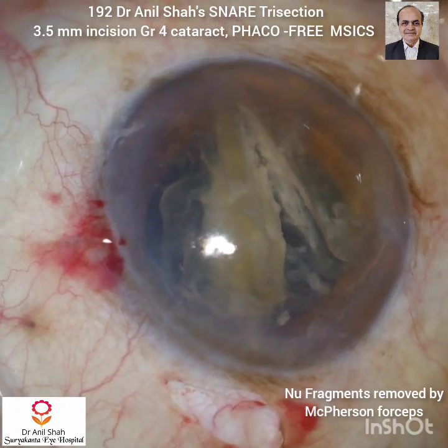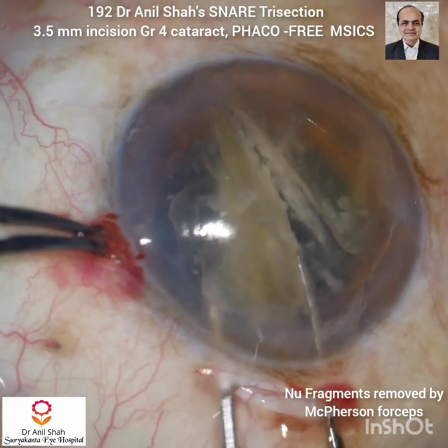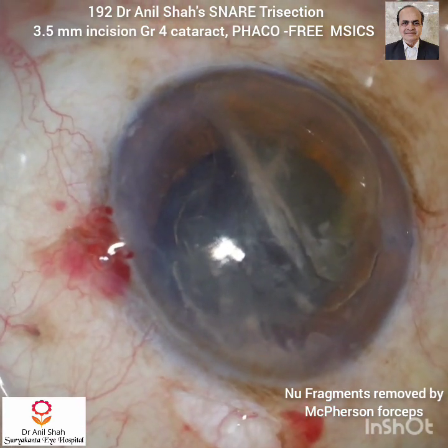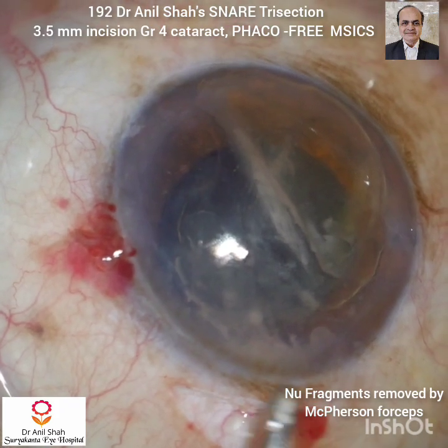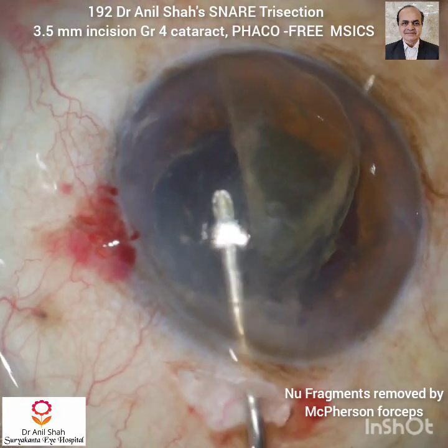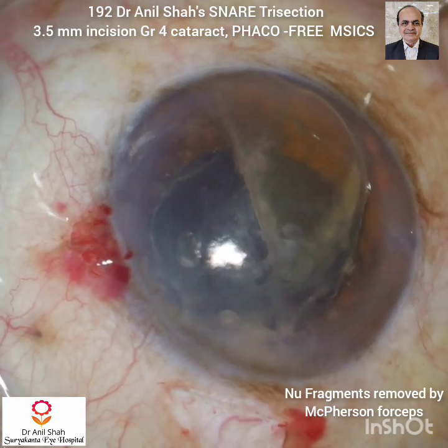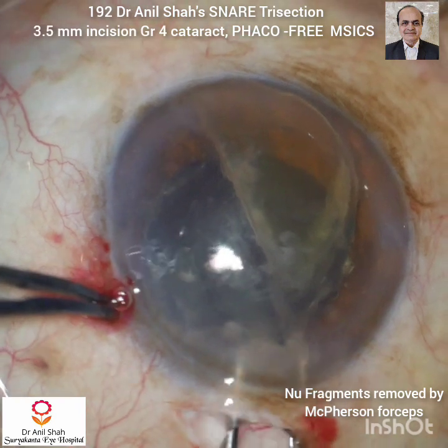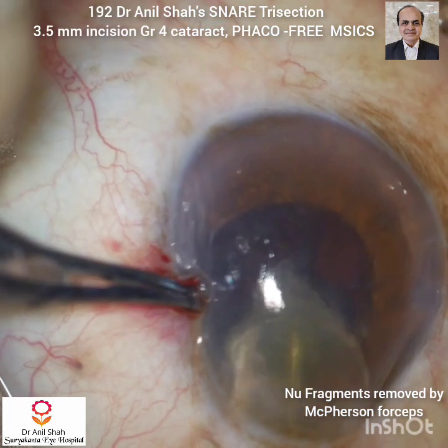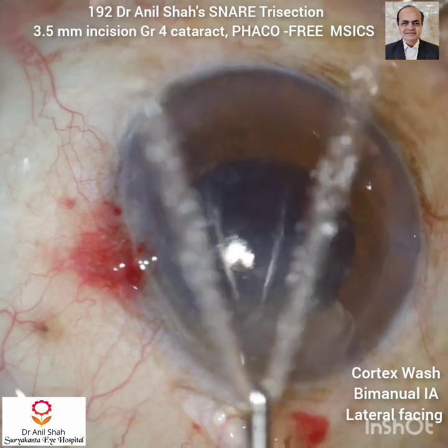The pole should be above the inner lip of the corneal tunnel. Now I will hold the middle fragment with the McPherson forceps along the entire length and take out the second fragment easily. Fill the chamber with HPMC or sodium hyaluronate and bring the nucleus into the center. Now with the McPherson forceps I will remove the last fragment. McPherson forceps is very easy to use and does not cause any damage to the endothelium or to the tunnel. It is a very smooth way of delivering nucleus fragments.